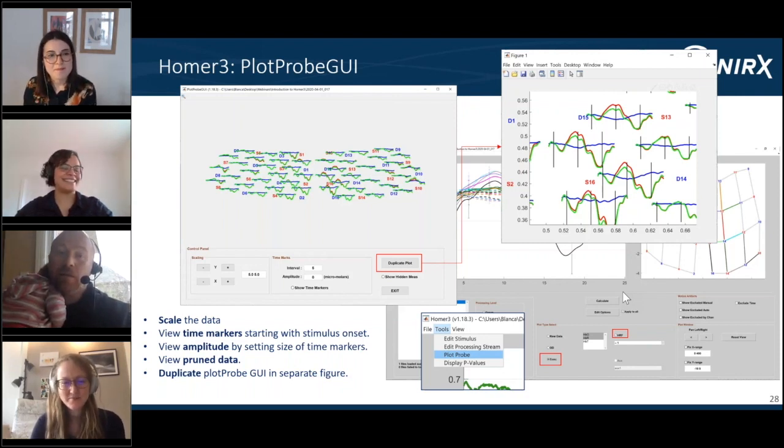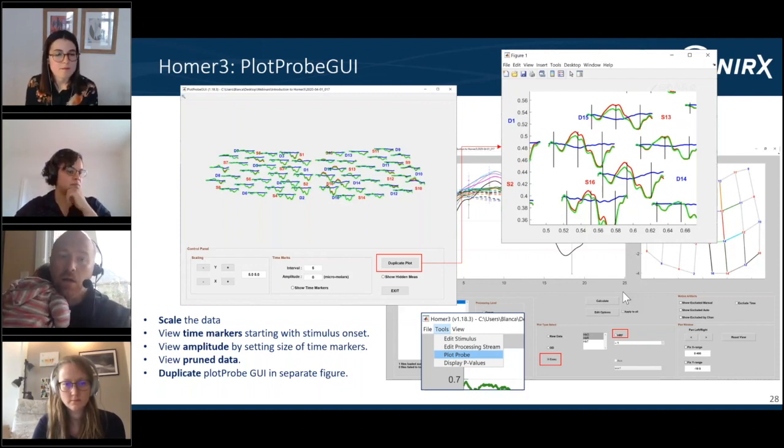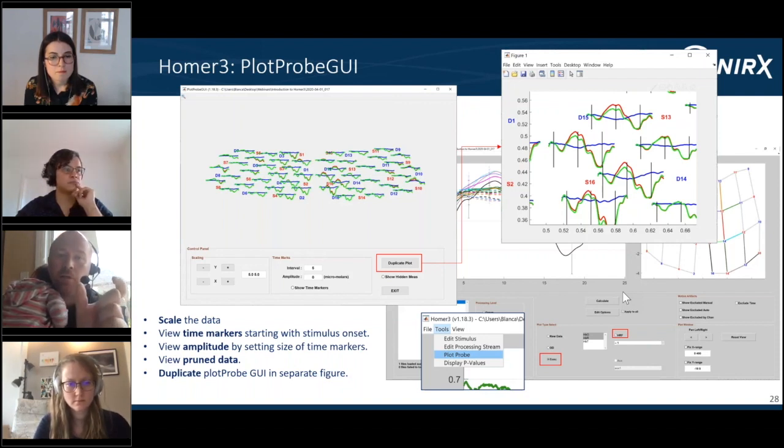So I can't speak to how Homer3 does pre-whitening. It does have some of the same algorithms that we gave code to that they put into the Homer3 software. In my analysis toolbox, we don't allow you to chunk out data like that. We just deal with the entire time course. That would certainly be a problem of whether or not you compute autoregression for each chunk separately or pool it. I don't know how it's done with Homer3.